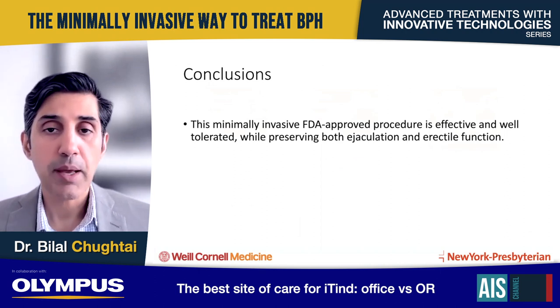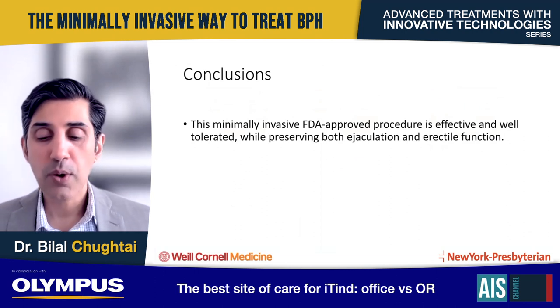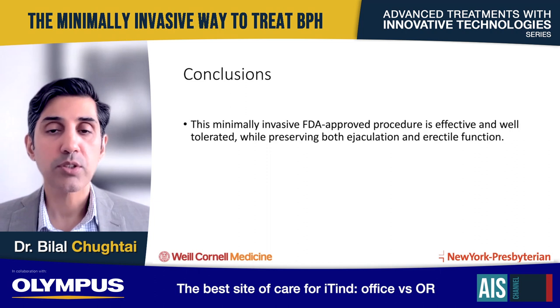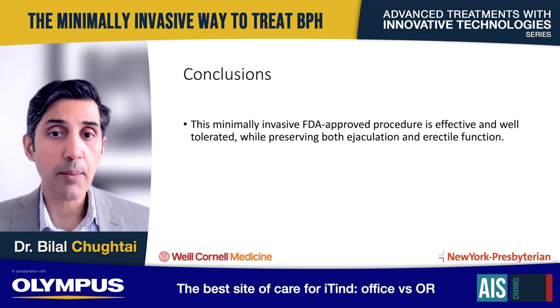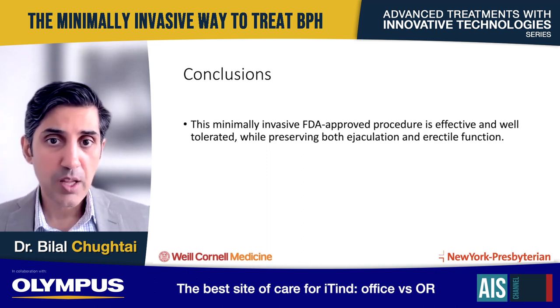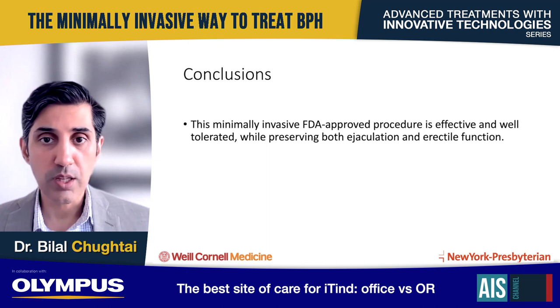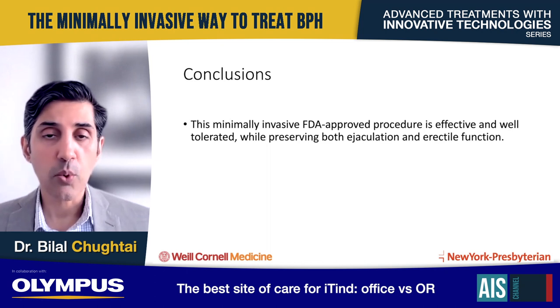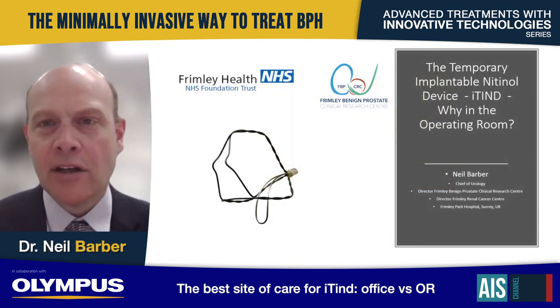In my practice, typically patients who have trouble tolerating office-based procedures, in other words, those who have difficulty with a flexible cystoscope itself, I typically will err to the side of doing it with a rigid scope within the operating room, which is very easy for the patient. For most patients who are able to tolerate flexible cystoscopy without difficulty, I will do it within the office. But again, this requires the additional use of a guide wire, as well as a ureteral access sheath.